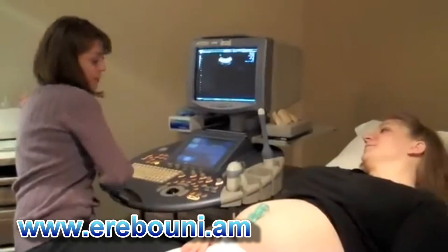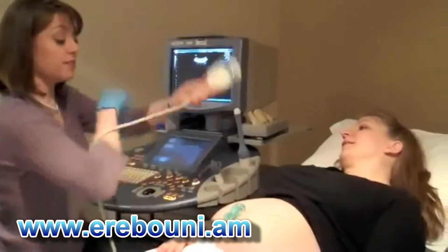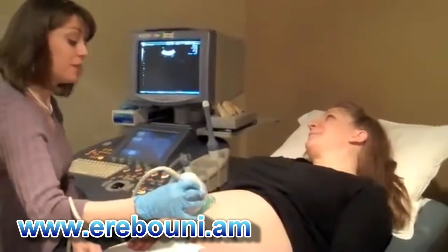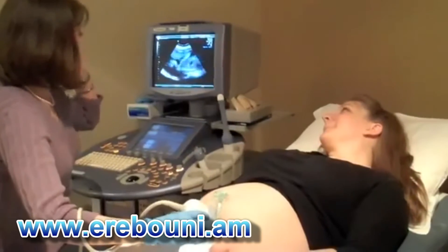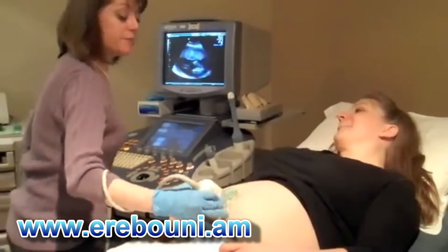With these images, the physician can examine the fetus and evaluate the progress of its development. This transducer will be moved across your abdomen as the fetal structures are examined.